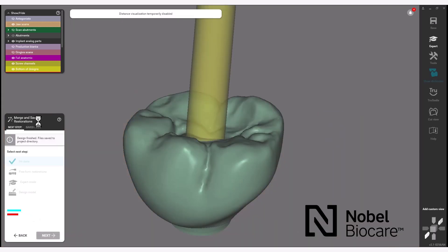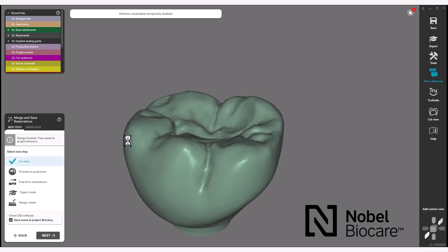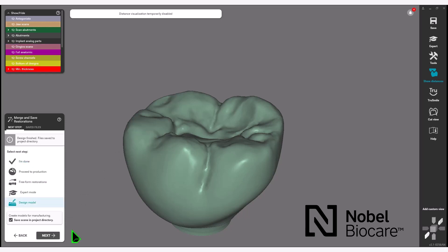Now you will come to the merge and save restorations step in the wizard. Your Novo Procera Full Contour Zirconia Screw Retained Crown with Angulated Screw Channel has been designed. Click Next to proceed through the wizard to send the order through the DentalDB DentalShare to Novo Procera Manufacturing.